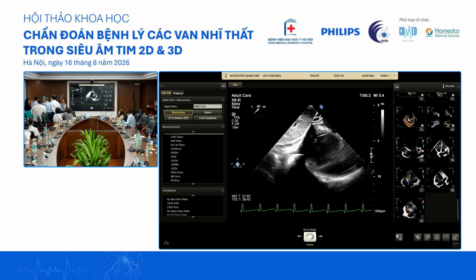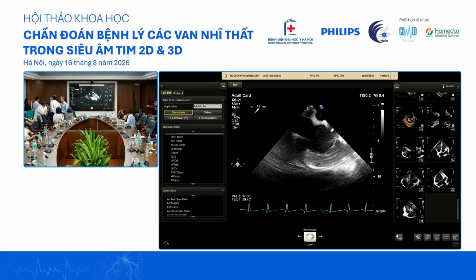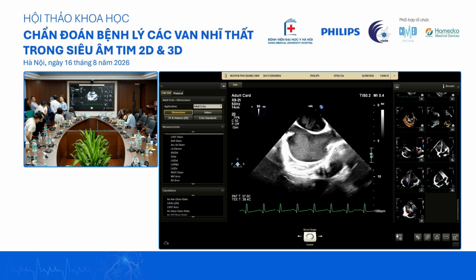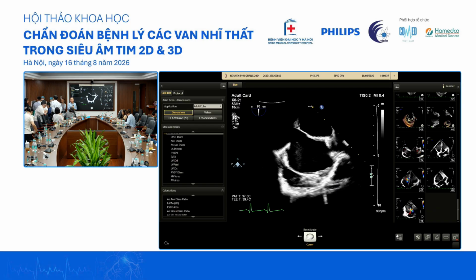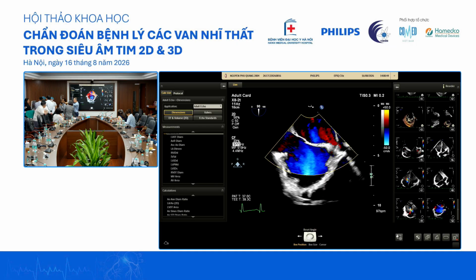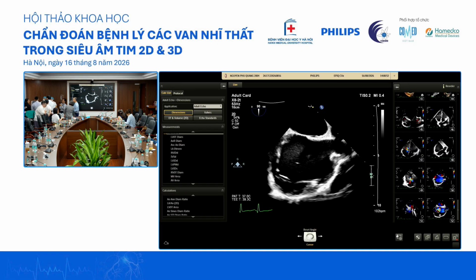Yeah, you can go now. Can pull out, go back to mid-esophageal 90 degrees. Mid-esophageal 90. You just look for color flow. I guess shunt being the most common. Yeah, so like what you say, either the sinus venosus of the IVC, but definitely the sinus venosus. Okay, so it's quite clear there's no sinus venosus of the IVC, SVC, unroofed CS. They are all quite not there.